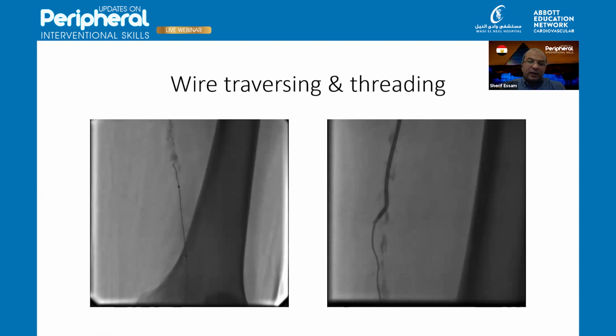As we said at the beginning, both common femoral arteries were heavily calcified and pretty challenging. I couldn't even go contralateral. Even the right leg, which is the asymptomatic leg, I couldn't go through the right common femoral artery because of heavy calcification. His femoral pulse was barely palpable because of the calcium, and with ultrasound you can hardly see a lumen in both femorals. So I wasn't happy to put a sheath in any of his common femoral arteries.